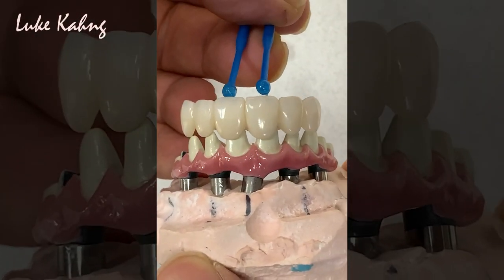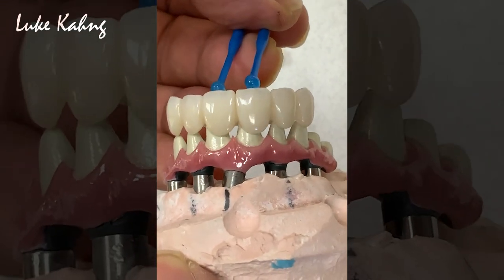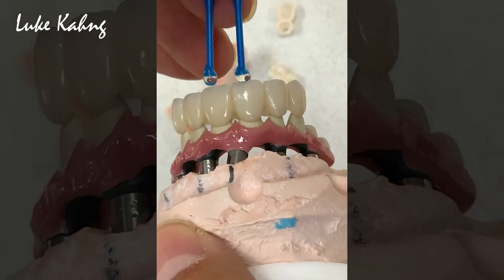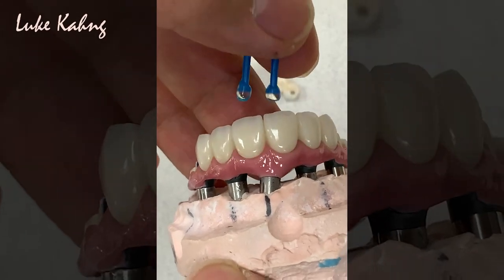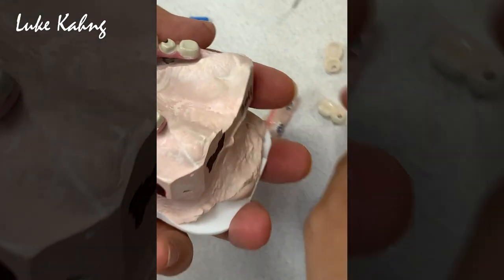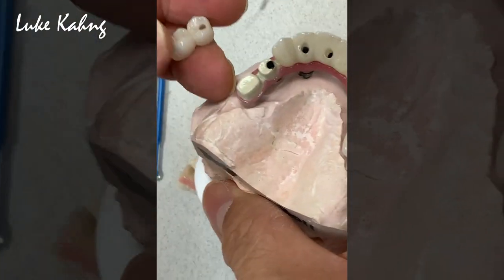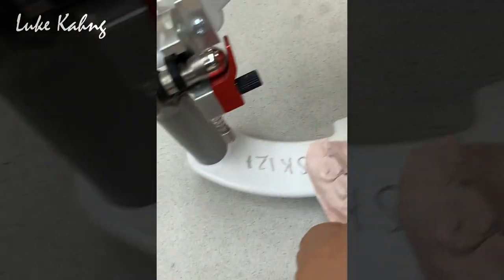That's another signature case. It's very delicate. I don't know why we have so many delicate cases. Let me explain to you guys regarding the occlusion. Okay, in the meantime, they're really good fitting, right? Aesthetics, it's done. And then here is the tooth, separate. So all monolithic, we fabricated. And then initially the patient had a problem with the occlusion.